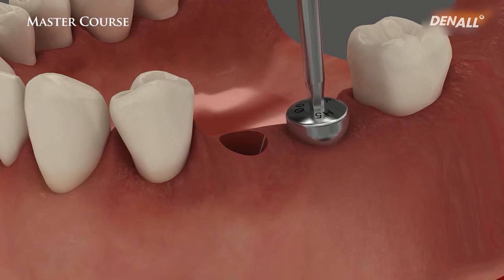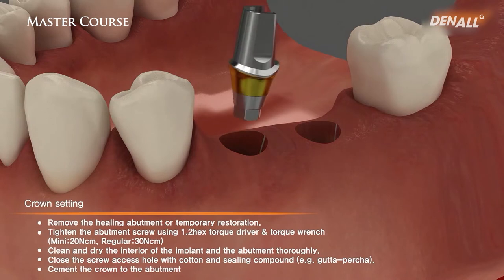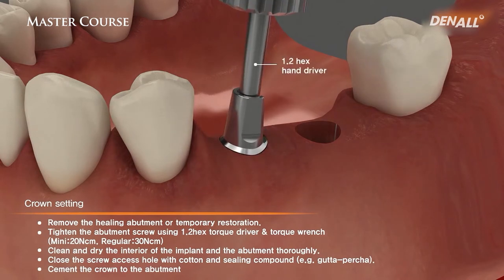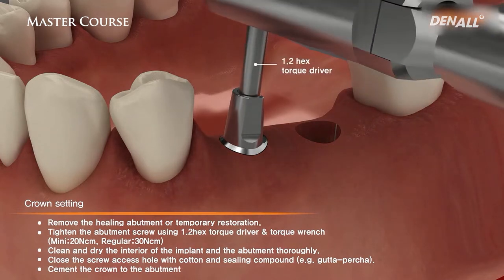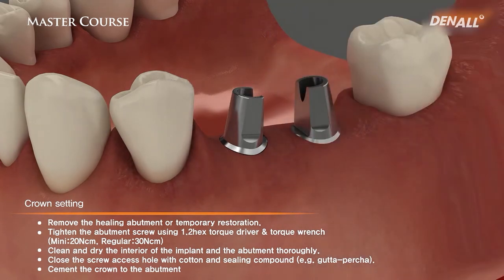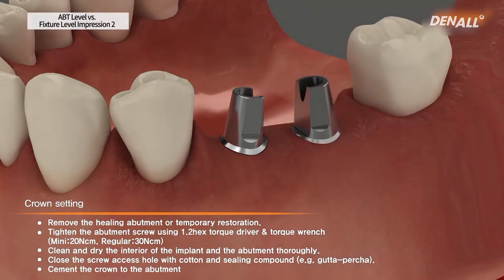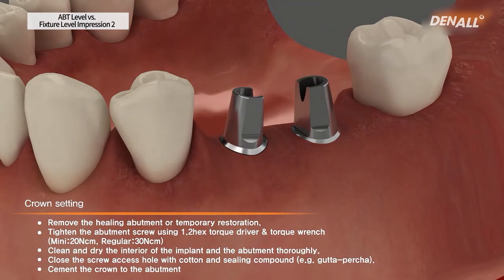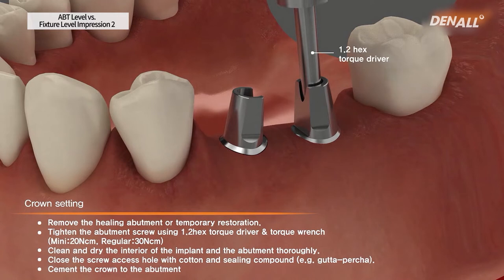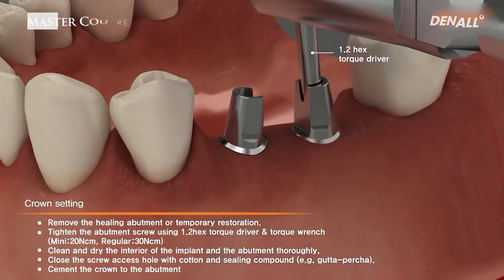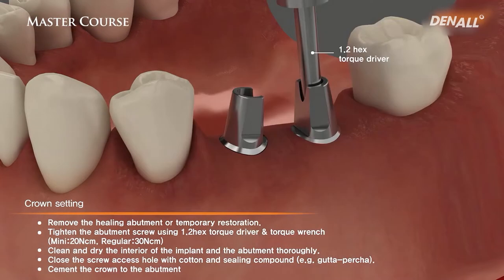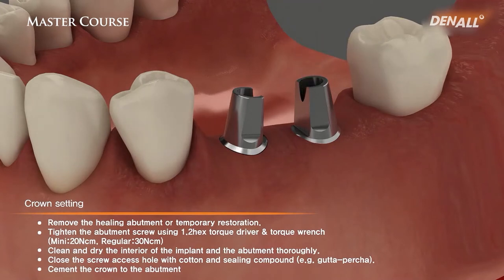The healing abutment is unscrewed again. Then the abutment, using the hex, is positioned, set, delivered, and connected correctly. The positioning created in the lab is used for the positioning in the clinic to go in the right place. With the cementation, everything will be complete. 3D positioning and how the impression coping is used for taking impressions — I hope that through this video you have gained more understanding.